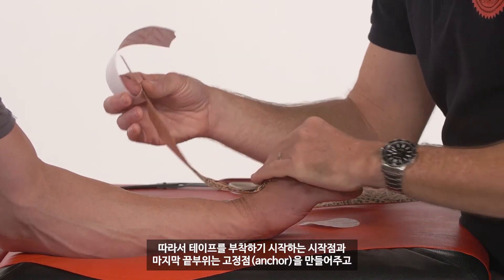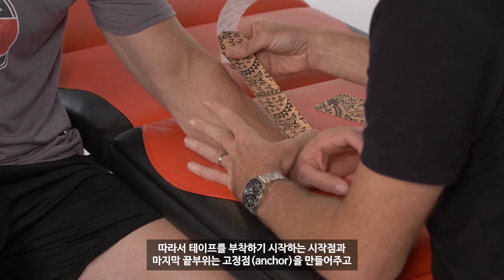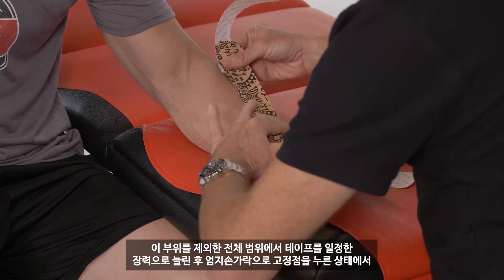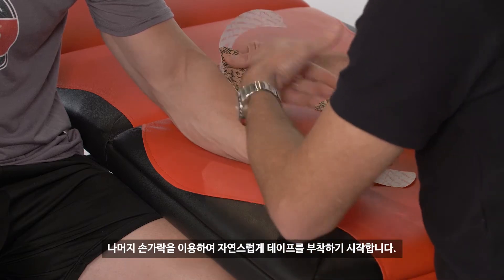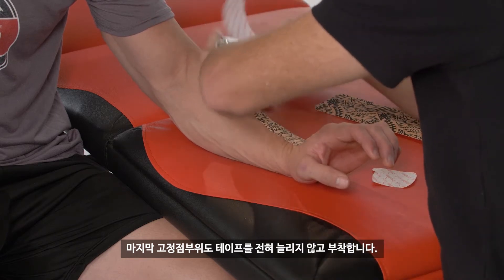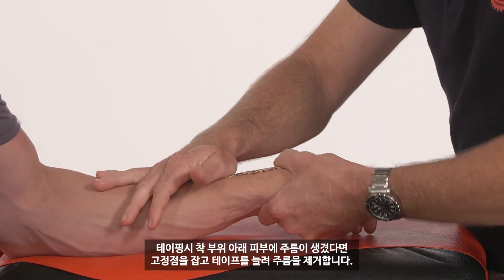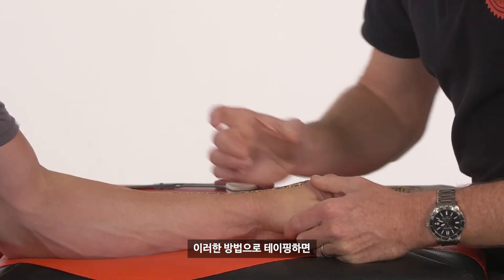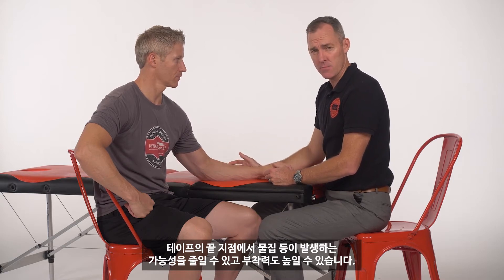What we do instead is we actually try to anchor and then get the tension along the entire piece of tape to keep that nice and uniform, and smooth down with our fingers as much of the tape as we can prior to letting go of our thumb, and then we can put this second anchor point on with absolutely no tension. That way if we do have creases we can pull out — making sure we hold our anchor point — and take those creases out. By doing it this way we don't focus all that force on the ends, we're going to get better adhesion and less likelihood of running into blisters.